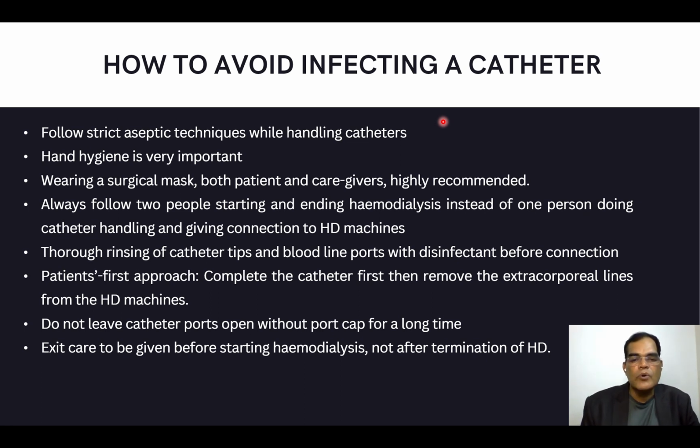It's always better to have two people, one to handle the catheter, another to give the connection to the extracorporeal set. So two-person is always recommended instead of one person handling the catheter. Thorough rinsing of the catheter tip before giving connection to the bloodline is very, very important, because this is one area where there can be contamination, because bloodlines are exposed too much in the machine, and the tip must have been touched several times.